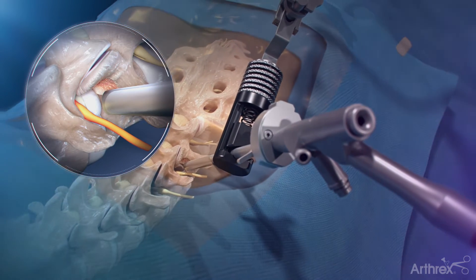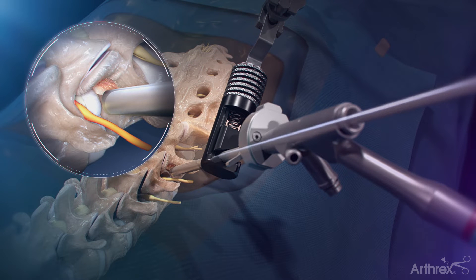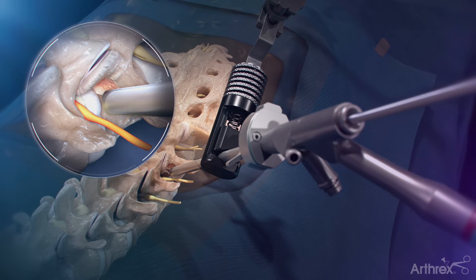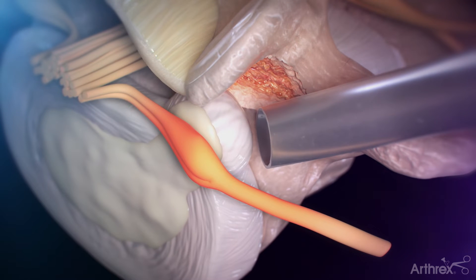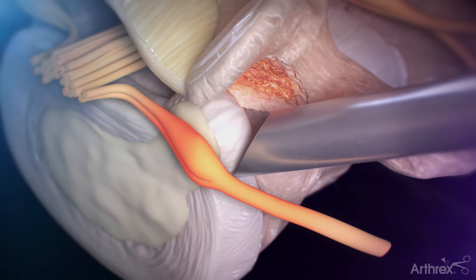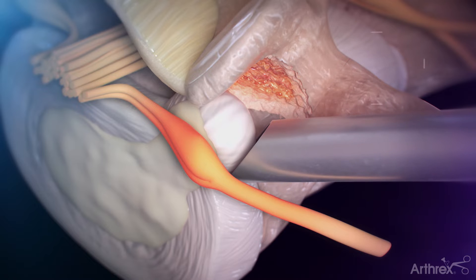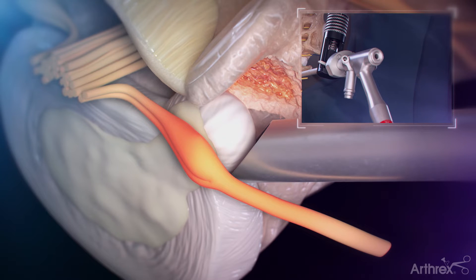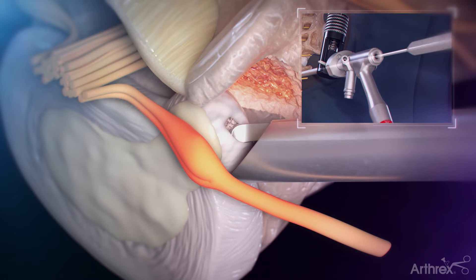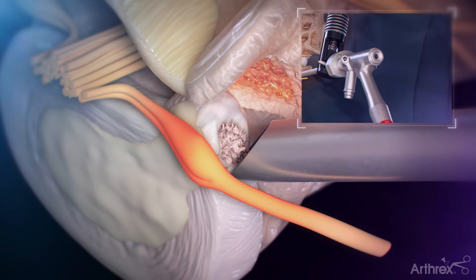giving surgeons greater surgical precision through an incision usually no larger than one centimeter. During a transforaminal discectomy, the surgeon is targeting what is called Kambin's triangle. This approach involves targeting near the compressed nerve root, retracting and protecting it during surgery, and removing disc material that has escaped from the nucleus.